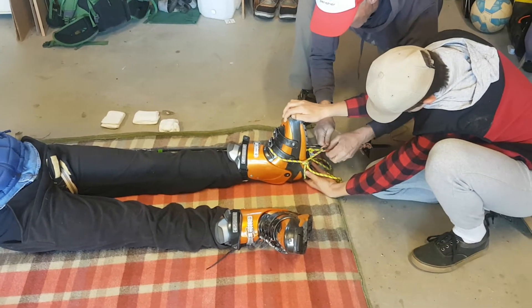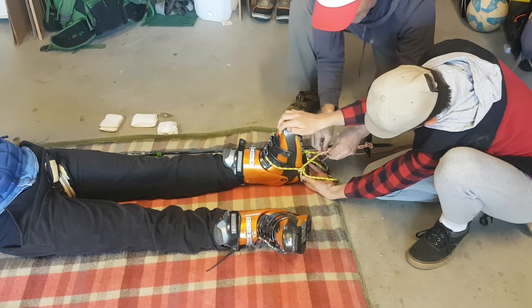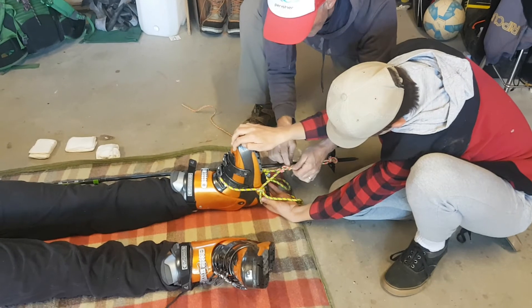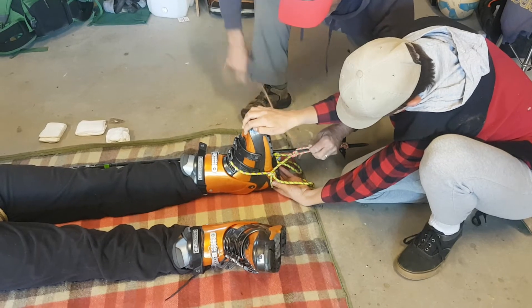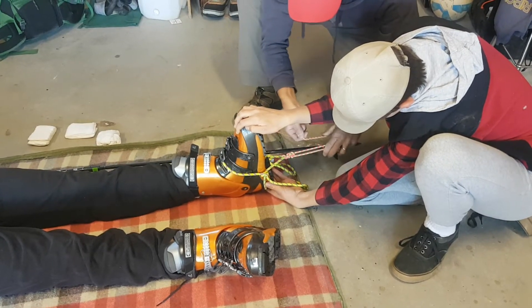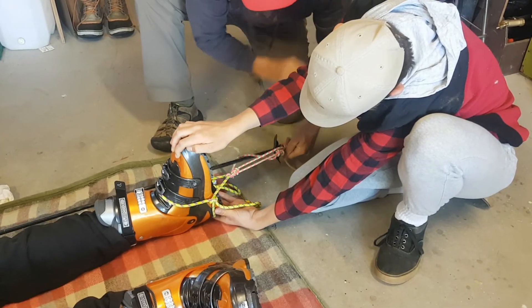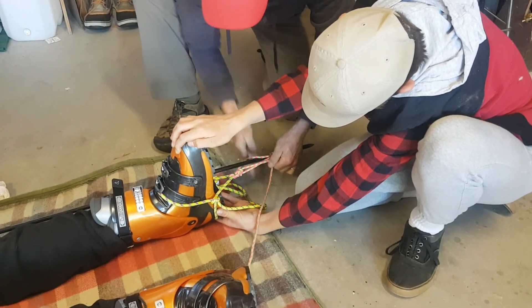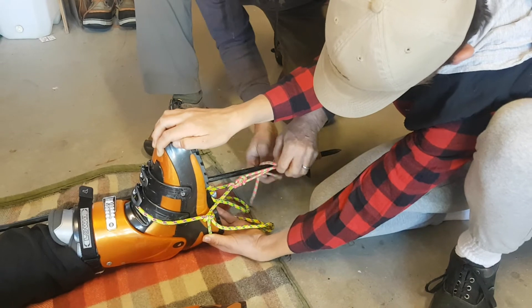We're going to tie a few half hitches here. You want these knots to be pretty good, because you don't want this coming undone, especially when you start to move this patient. Think about how you're going to get this guy out — unless you're close to the trail head for a stretcher haul, or in good terrain where you can get a skidoo to him. Generally, this guy is going out in a helicopter, and this is pretty much a SOS, PLB, or inReach situation. But you can see you can make a pretty good improvised traction splint from what you've got in your pack.